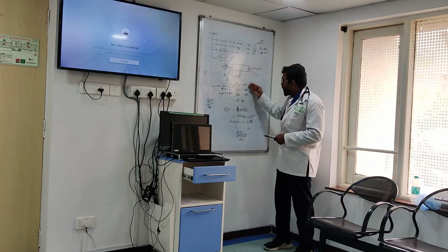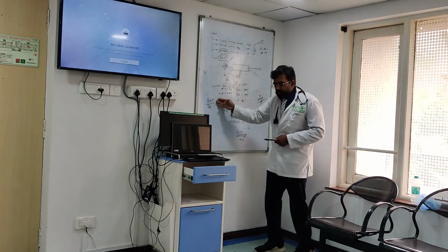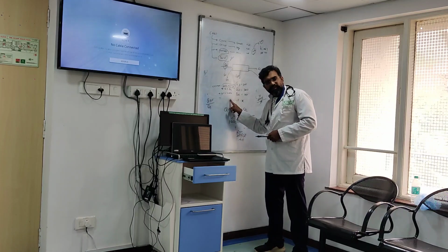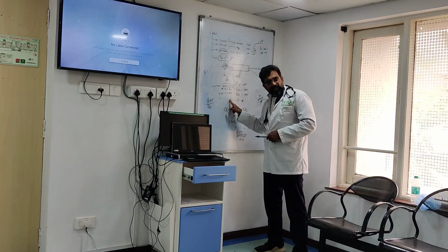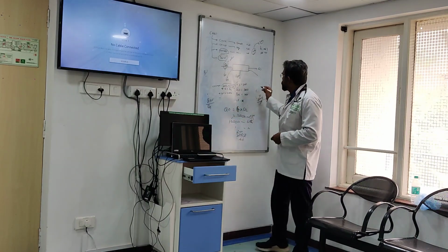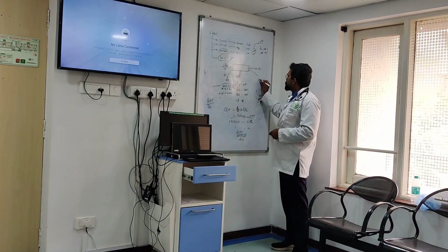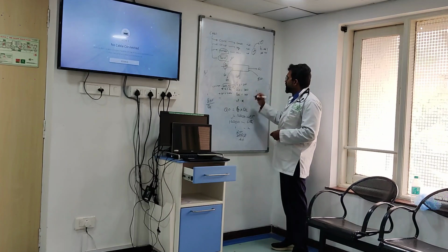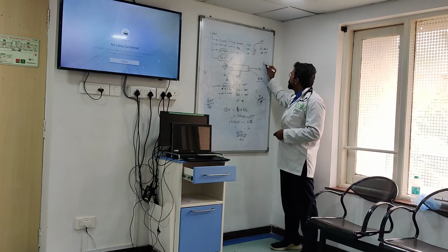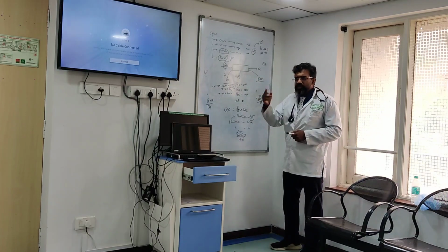Right? Now, when I go up on this, my effluent is going to go up. If my effluent goes up, my filtration fraction will increase. Are you understanding? समझ में आ रहा है? So if I put 3,000 plus 2,000 is 5,000, that's my effluent. And my blood pump, say I call it QB, maybe I forget the hematocrit, let's just put the blood pump.